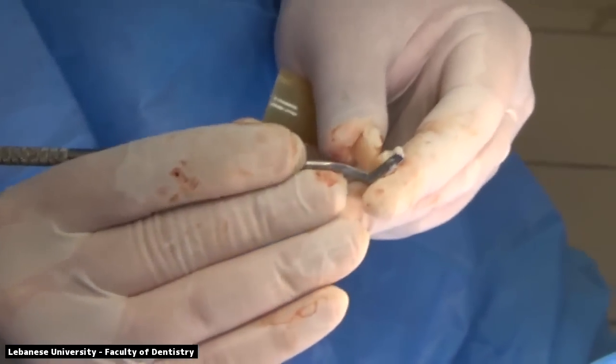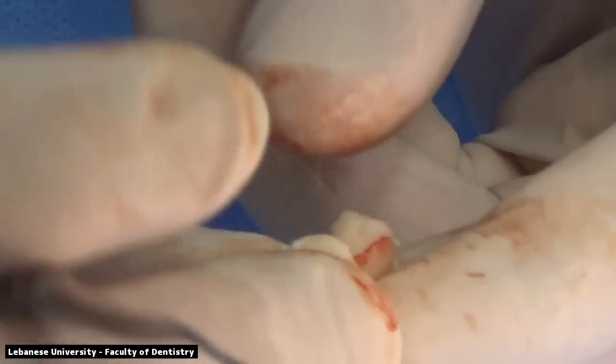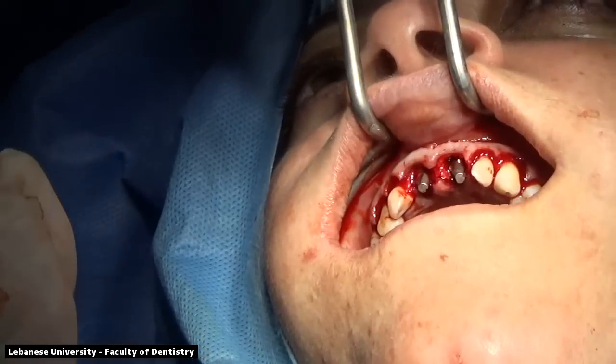Adding our acrylic temporary restorations. So we're adding our acrylic material into the inner surface of the relieved temporaries. These are the shells with the temporary material placed inside.